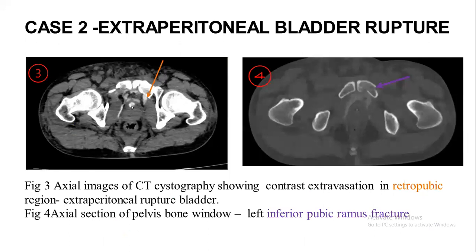Case 2 is extraperitoneal rupture of the bladder. Figure 3 shows axial images of CT cystography demonstrating contrast extravasation in the retropubic region, indicating extraperitoneal bladder rupture. Image 4 is an axial section with bone window showing fracture of the left inferior pubic ramus.